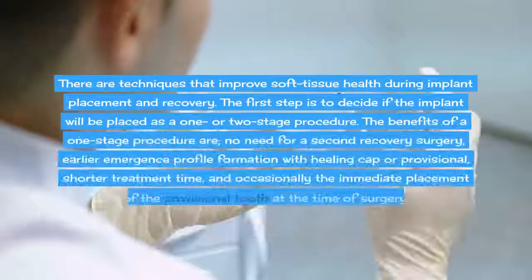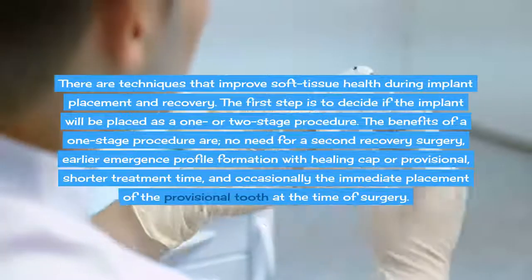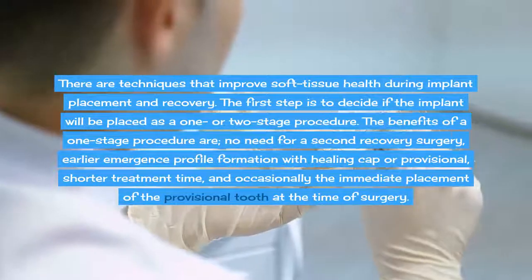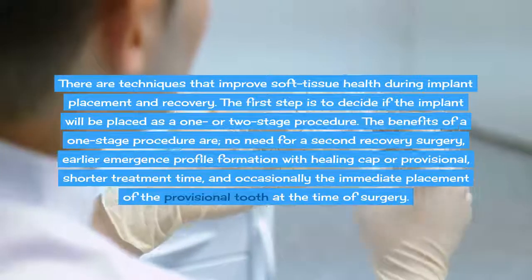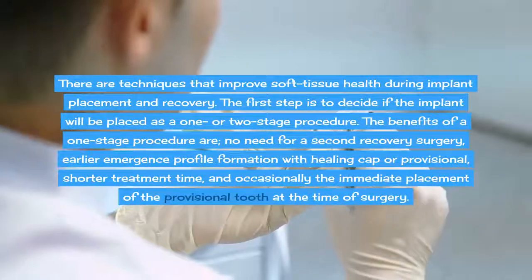Step 5. Surgical strategies at implant placement. There are techniques that improve soft tissue health during implant placement and recovery. The first step is to decide if the implant will be placed as a 1- or 2-stage procedure. The benefits of a one-stage procedure are no need for a second recovery surgery, earlier emergence profile formation with healing cap or provisional, shorter treatment time, and occasionally the immediate placement of the provisional tooth at the time of surgery.